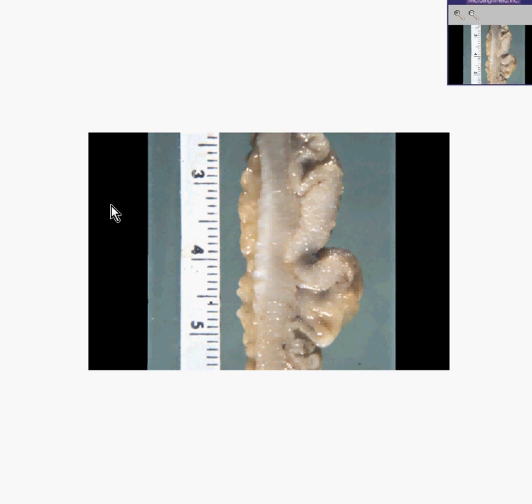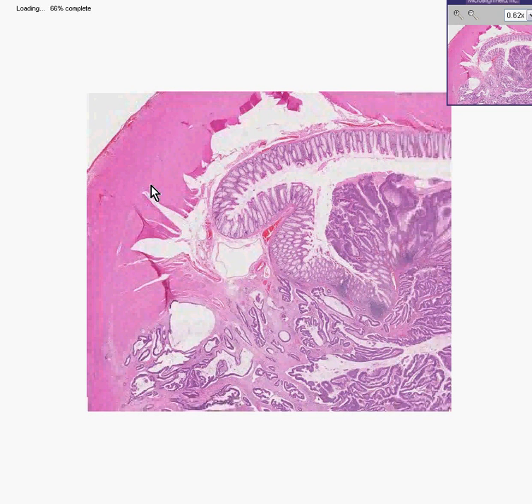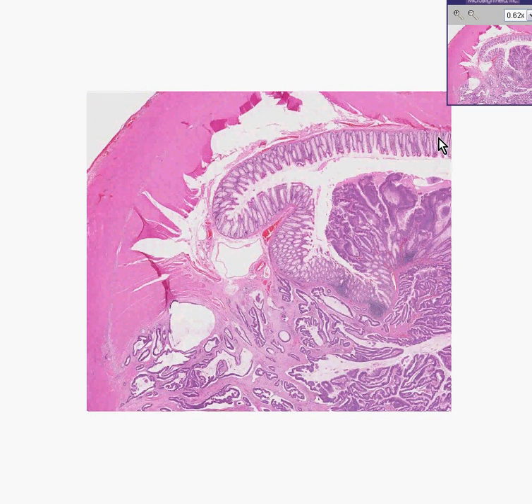Let's look at it microscopically. I think I could convince you this is normal mucosa. It looks like the submucosa has been ripped away a little bit, and there's even some ripping of the muscular layer here. All this pink stuff is muscle.